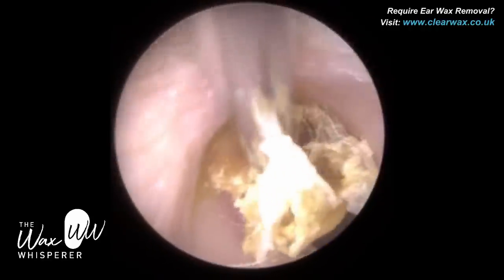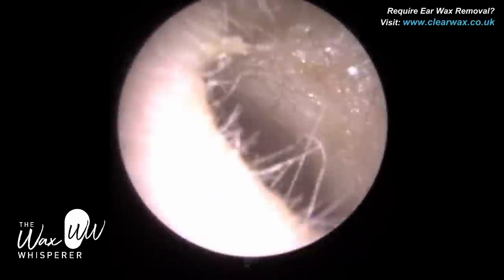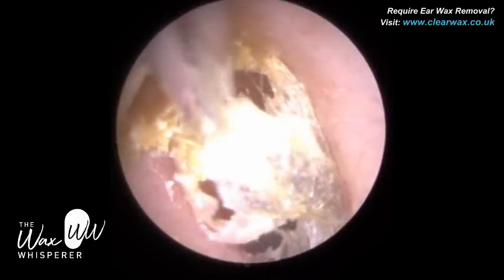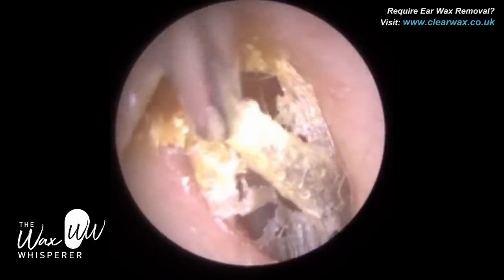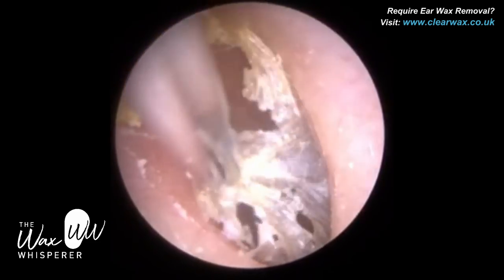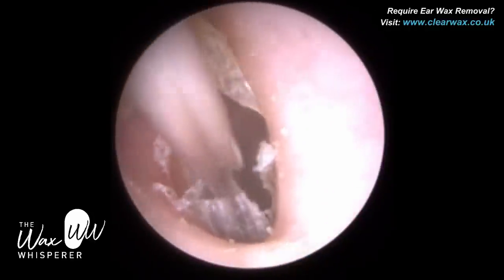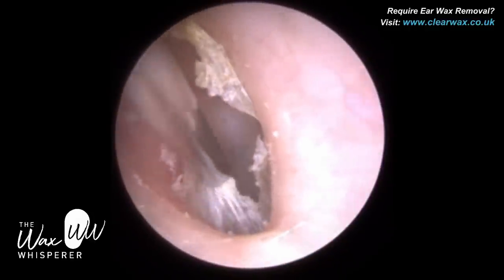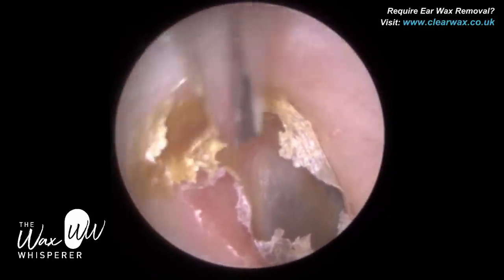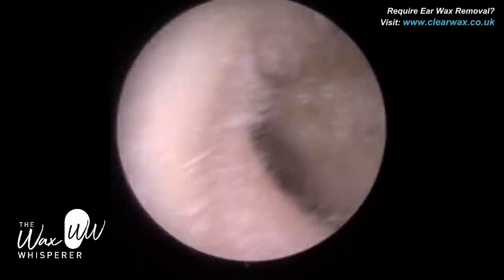A hearing aid whistling is called acoustic feedback or a feedback loop. It's triggered by the sound that's amplified into the ear canal. If that amplified sound is reflected back out of the ear and re-enters the hearing aid microphone, the hearing aid reprocesses and amplifies sound that has already been processed. As that sound bounces back out of the ear and re-enters the microphone, we get this loop — a feedback loop — and it creates a really loud high frequency squeal. It's very annoying, not only for the patient but for those around them.